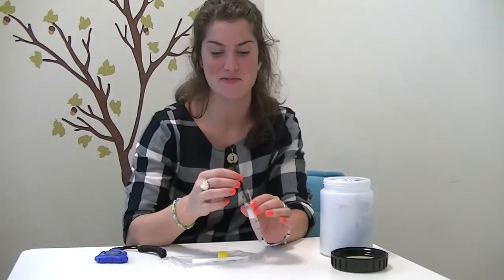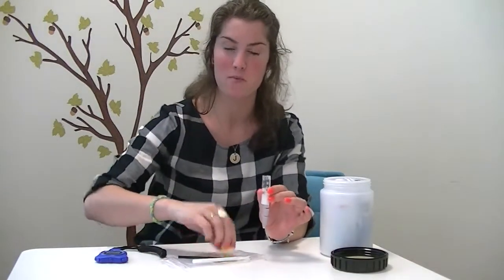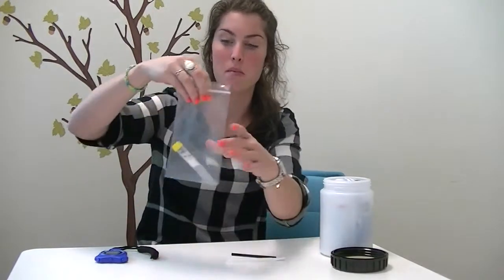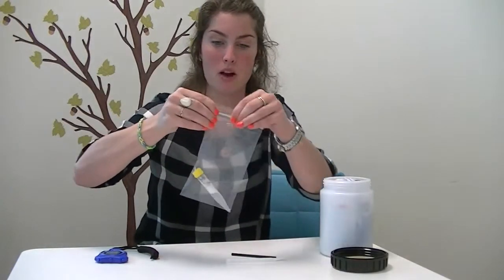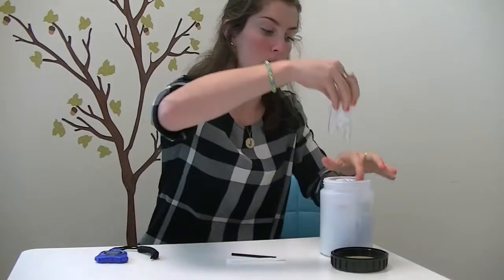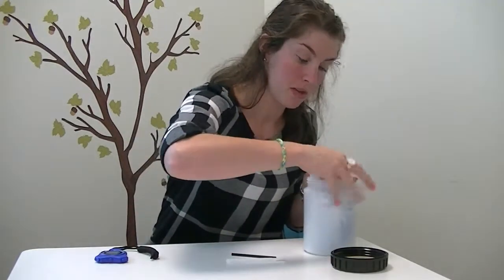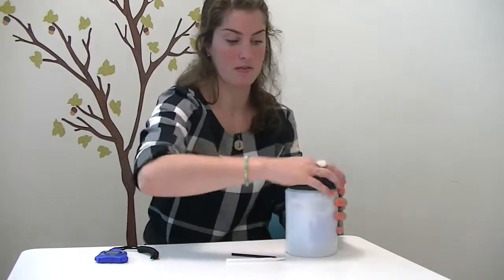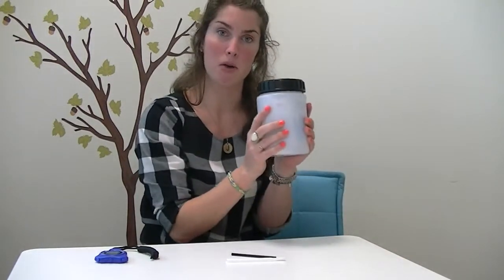Well done! You've just done your first saliva sample. Take out your straw and put your yellow lid on nice and tight. Put your saliva sample back in the Ziploc bag, close the Ziploc bag, and put it back inside the biobottle. Make sure it's surrounded by all the ice so that it can freeze and then stay frozen. Put your biobottle lid on nice and tight, put your biobottle back in the freezer, and throw away your straw.